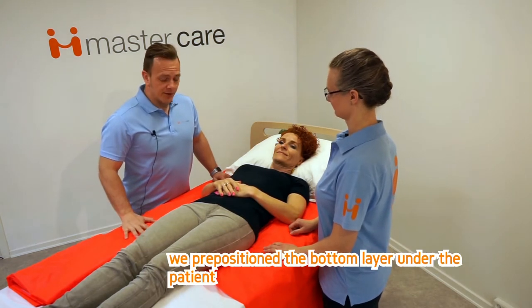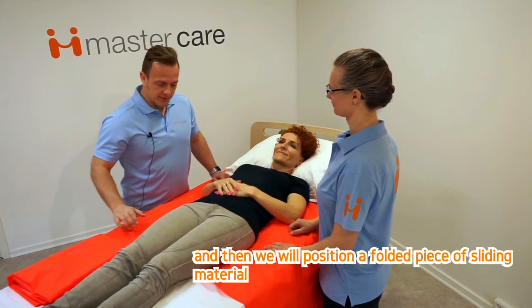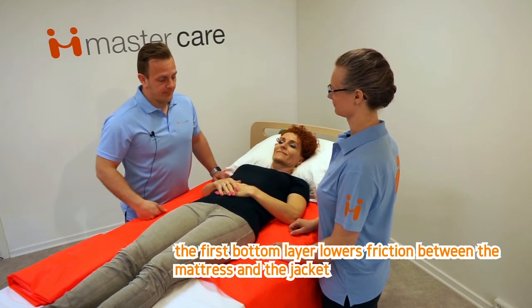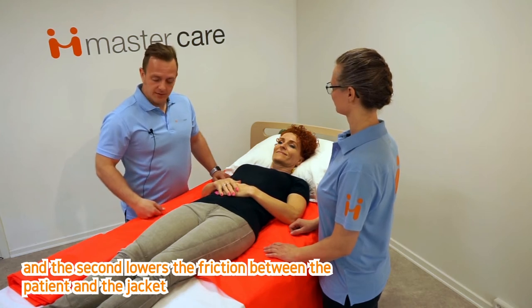We have pre-positioned the bottom layer under the patient and then we'll position a folded piece of sliding material. The first bottom layer lowers friction between the mattress and the jacket, and the second lowers the friction between the patient and the jacket.